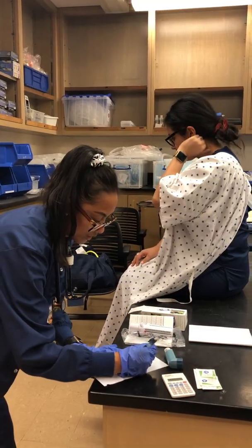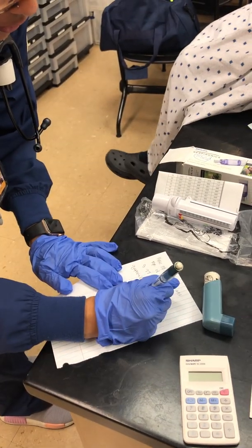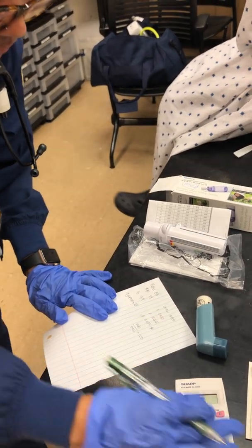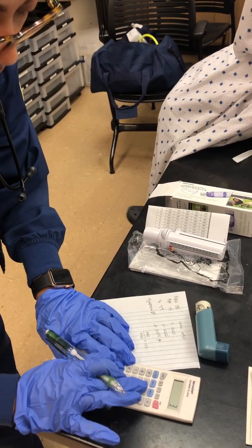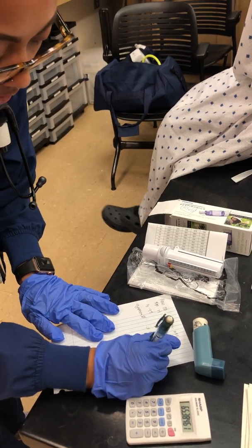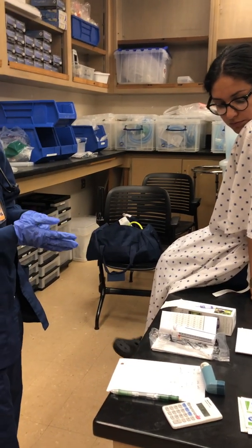Okay, so I'm gonna do some math. I'm gonna put the best, which is the 255 over the predicted, so 390, times 100. I'm gonna do that math real quick. 255 divided by 390 times 100. Okay, so 65% is what your lungs are working at right now. So you would benefit from some albuterol.